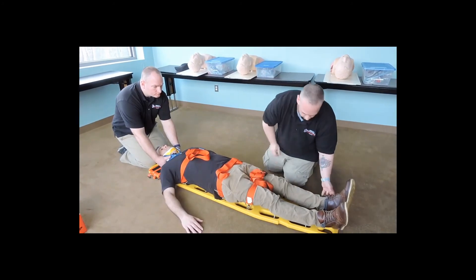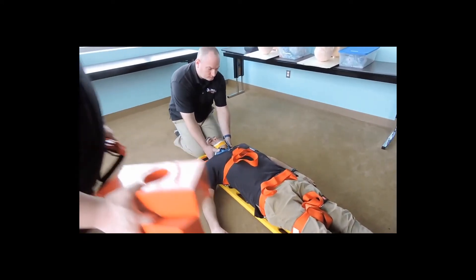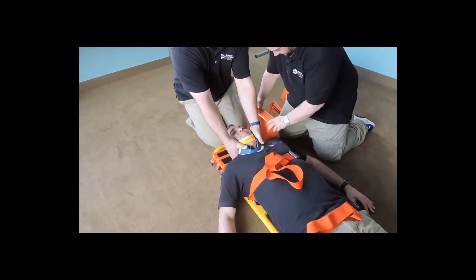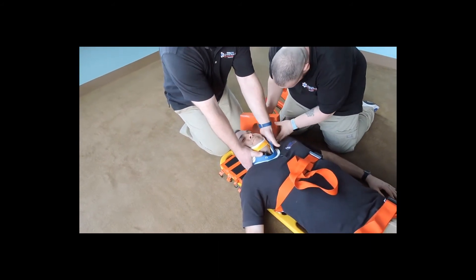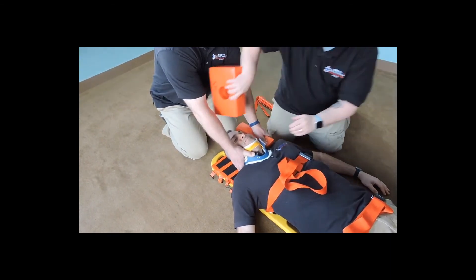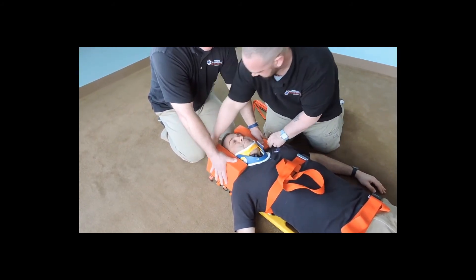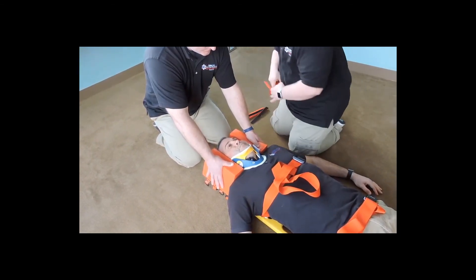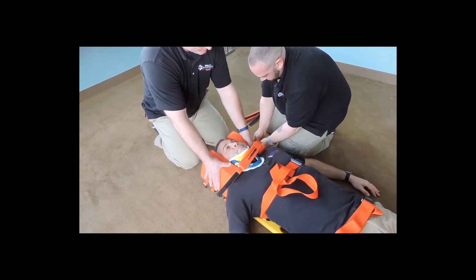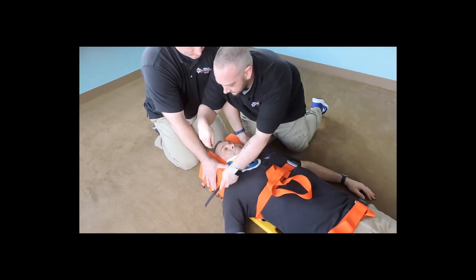All of our straps are secure — give a finger's breadth. You doing okay, sir? Now as a last step to securing the patient to the board, we're going to use our head blocks. I'm going to work around my partner. I'm going to make sure that this block comes in. Slide your hand out, take over the block so as not to release C-spine. We're making sure this secures against the head into the shoulder. My partner has immobilization and I'm going to secure with straps — coming under the collar, making sure not to cause deformity. We will secure this to our block.